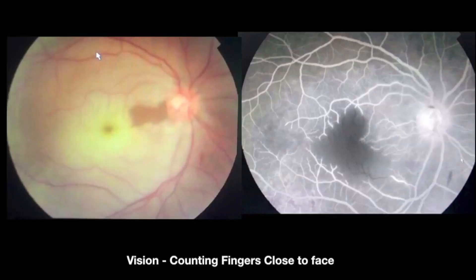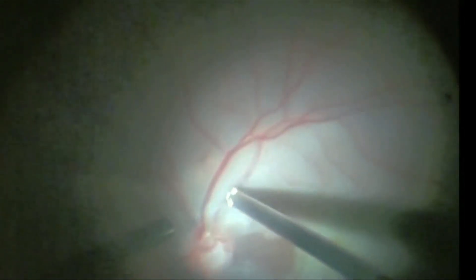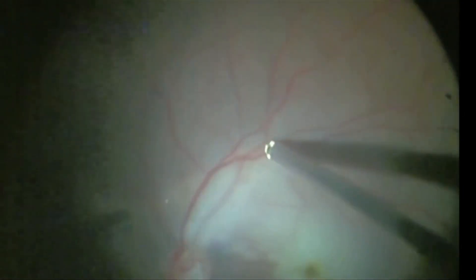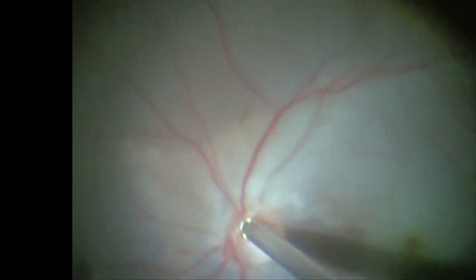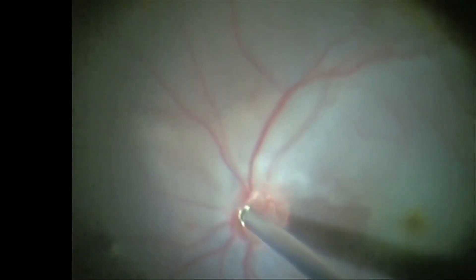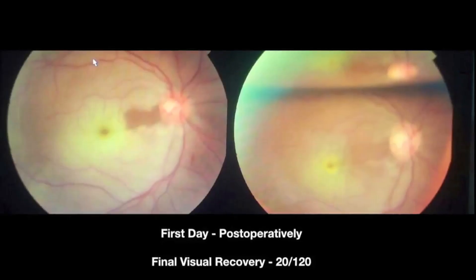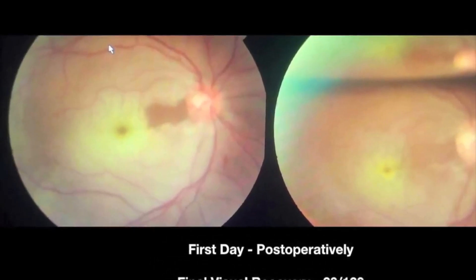The next patient had a central retinal artery occlusion after a mitral valve surgery. This was a challenge as the embolus was large and had to be literally milked to the periphery. Once the central retinal artery starts pulsating at the laminar area, the rest of the embolus is easily dislodged. This patient did very well and went on to regain 20/120 vision on the first post-operative day.